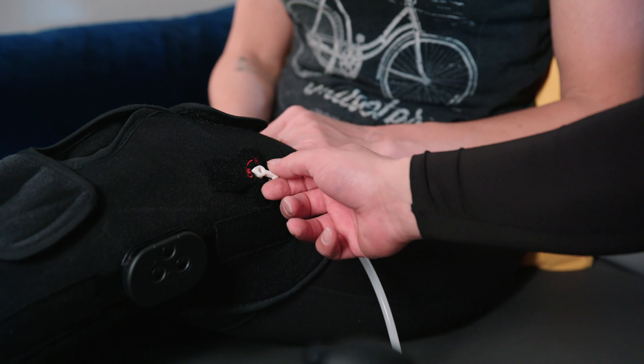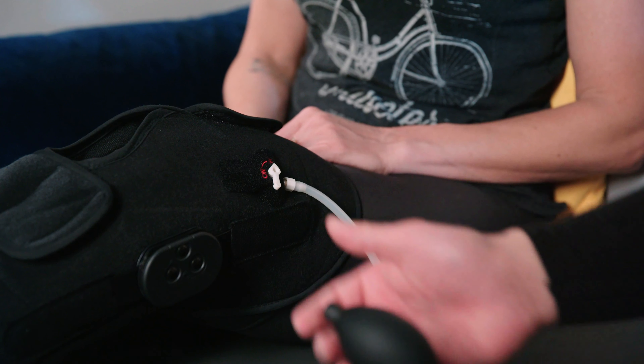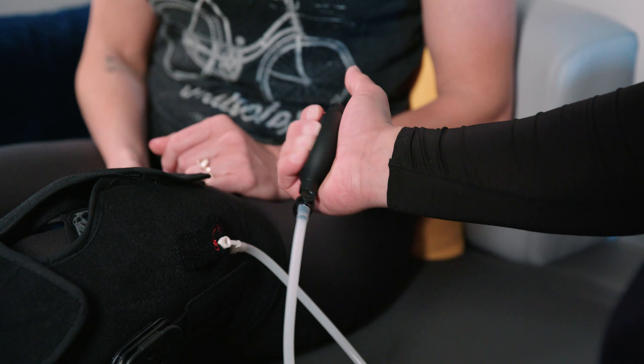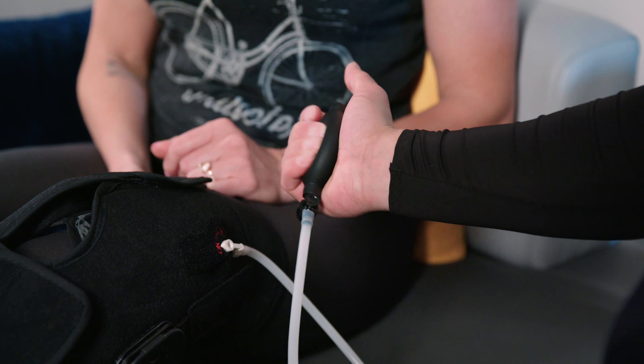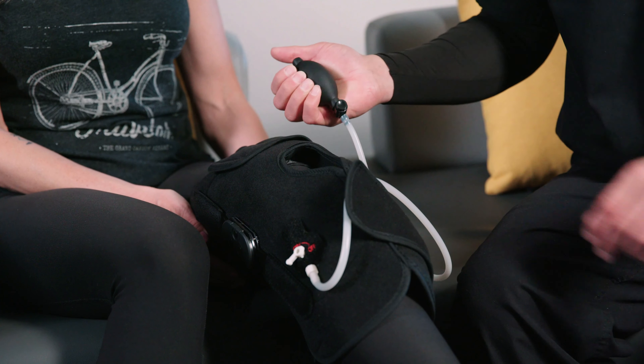To inflate, you want to make sure the switch is on. If the switch is on off, you will not be able to inflate. With the hand pump, squeeze about 10 to 15 times until the air bladder is compressed and you feel the ice pack compressed towards your knee.